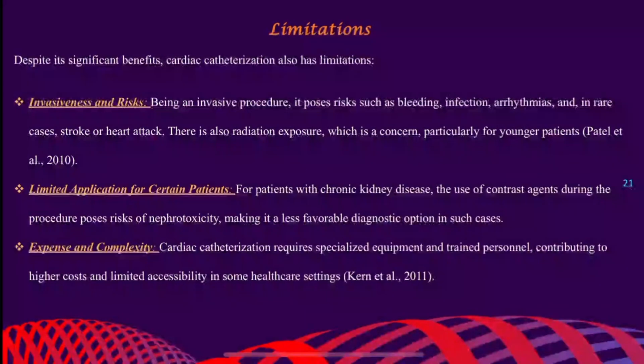Limitations. Despite its significant benefits, cardiac catheterization also has limitations. Invasiveness and risk. Being an invasive procedure, it poses risks such as bleeding, infection, arrhythmias, and in rare cases, stroke or heart attack. There is also radiation exposure, which is a concern, particularly for younger patients.